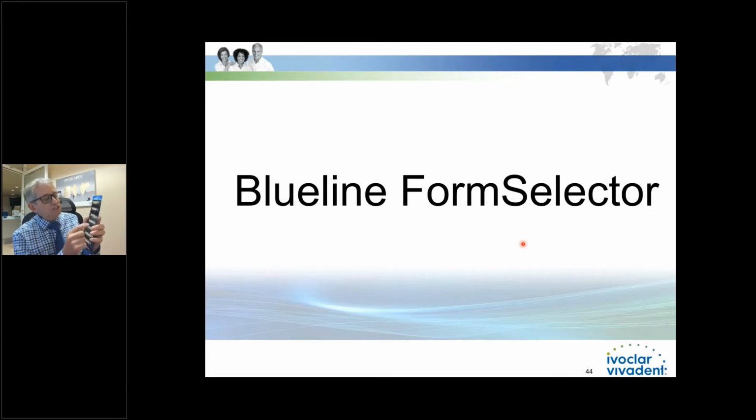Perfect. I would tell you to go and copy this on your copy machine, circle it, have the patient initial it, and then put it in the record. And make sure that that's the teeth that you let them try in. That way it's good for the front office. If they call you up and say, I just lost my right front tooth, you'll automatically, just with a picture, know what mold it is and everything. But you just have to be careful with the length.